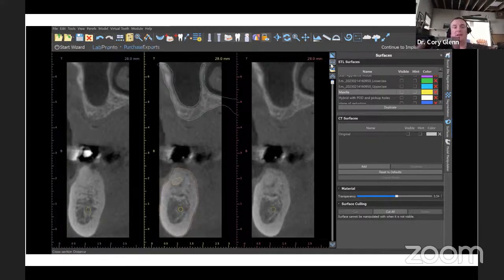But especially with any of this machine learning stuff, the dream is to one day, if you have a PFM crown on every tooth, that the AI has potentially been fed so many cases where that has been corrected and it sees the errors of where it's maybe segmenting scatter as opposed to actual tooth, that it will learn so much over time that it might give you an excellent segmentation where the scatter is almost not even an issue. So definitely an important point to submit those cases if you do run into problems.